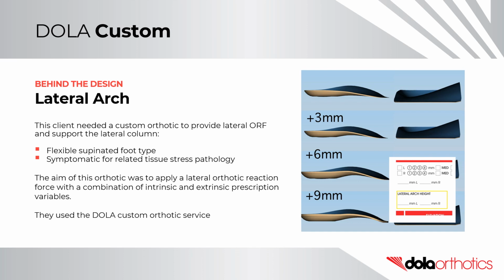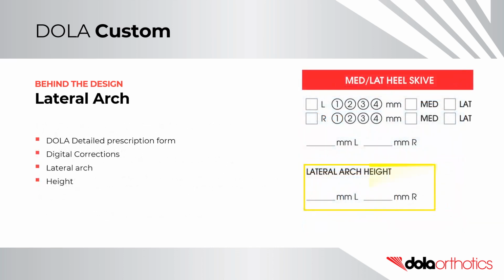The aim of this orthotic was to apply a lateral orthotic reaction force with a combination of intrinsic and extrinsic prescription variables. They used the DOLA custom orthotic service. They selected the height of the lateral arch in the digital corrections section of the DOLA detailed prescription form.